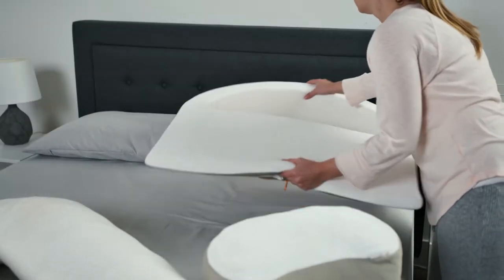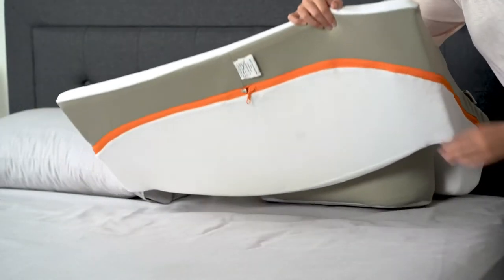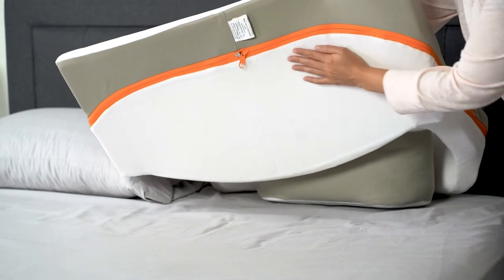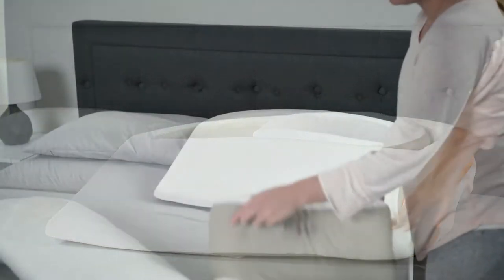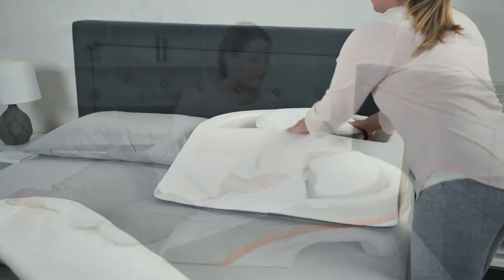Once all the components are fluffy and ready for use, place the reflux relief wedge at the head of the bed. Ensure it's right side up by keeping the flat portion where the zippers come together on the bottom. Next, insert the insert pillow — the one that looks like a kidney bean — into the inner cavity at the head of the base wedge.